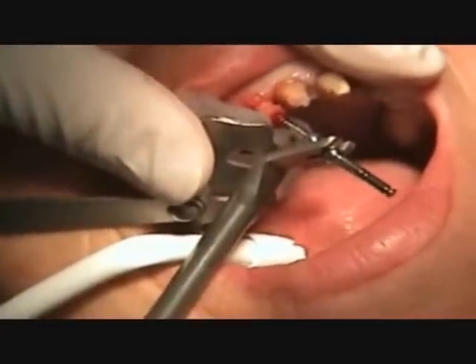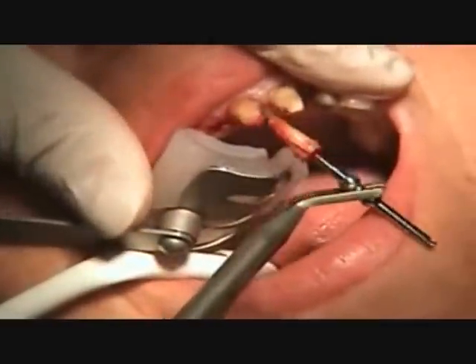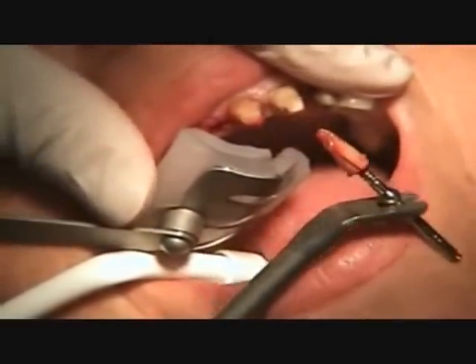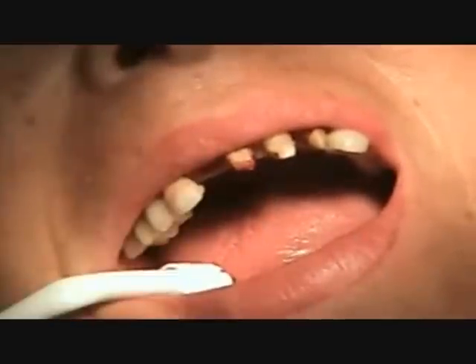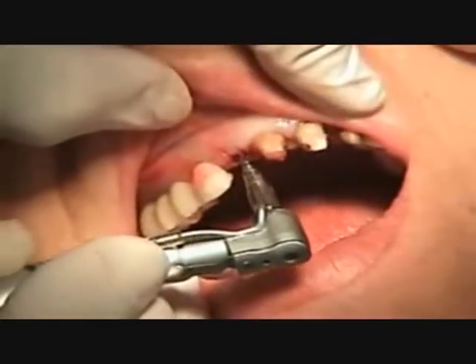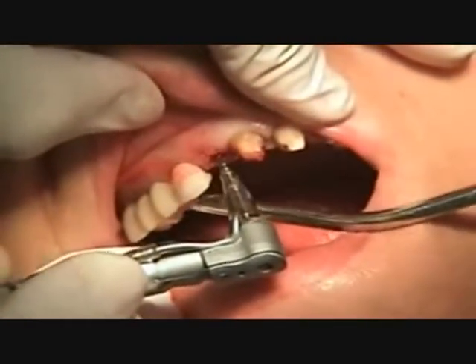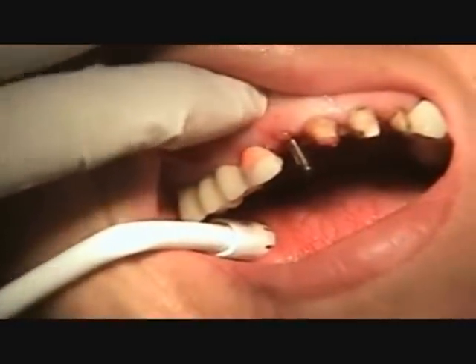Boom — out it goes. I'm just going to remove it slowly so you can see it. With minimal effort and no trauma to the bone and no trauma to the tissue, we're ready to go. The root socket was intact, so now we're going to use a pilot burr with copious irrigation. The bone seems pretty soft.